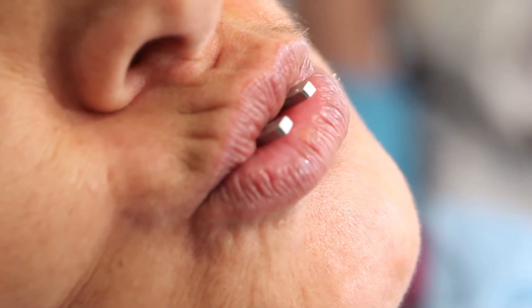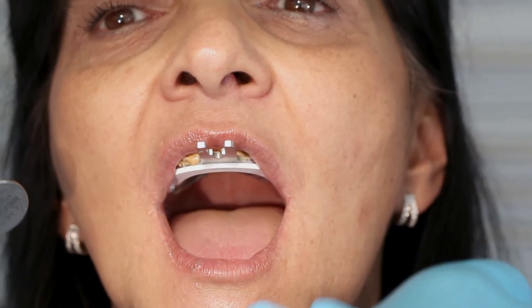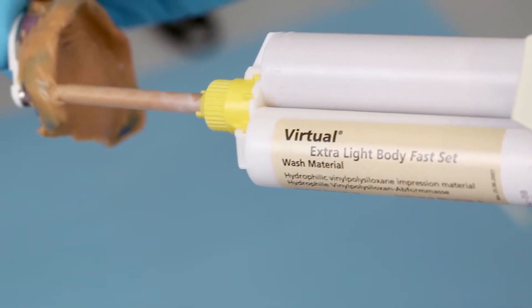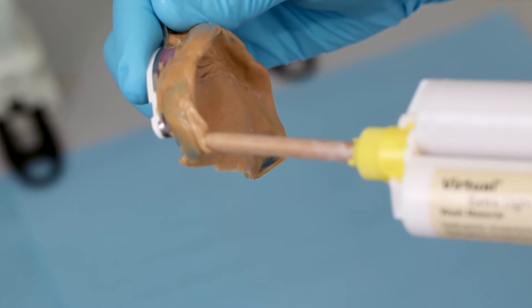Small voids and inaccuracies can be corrected with the virtual extra light body. Proceed in the usual way. When the tray is removed, you should be able to feel the suction effect.